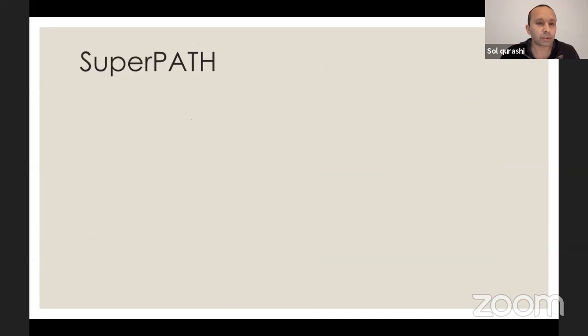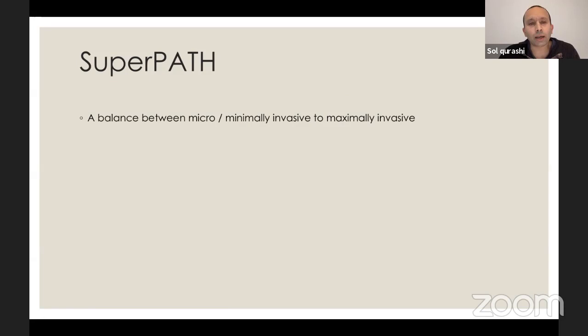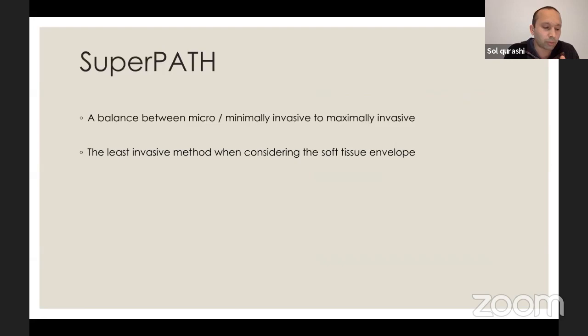So getting back to SuperPath, the way I see SuperPath, I think it's a balance between micro, they call it micro-invasive, though obviously no one uses the microscope to do it, and minimally invasive concepts all the way to maximally invasive. The reason I say that is because you can either do a SuperPath case and completely preserve all the soft tissue envelope, or you can release a little bit more until you've converted it to a full posterior approach. So you can do it at your level of comfort. You can be as maximally or minimally invasive as you like, because the salvage option is very easy.